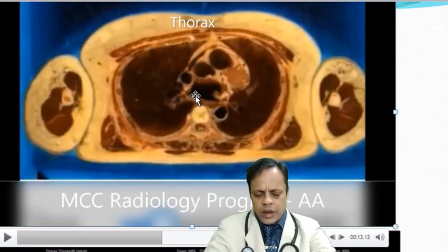You can see, I just told you, the left atrium, the ascending aorta, and this is the descending aorta. Here you might not appreciate it well, but here you will find the esophagus. So let us proceed further.